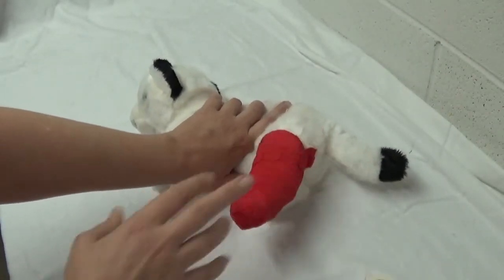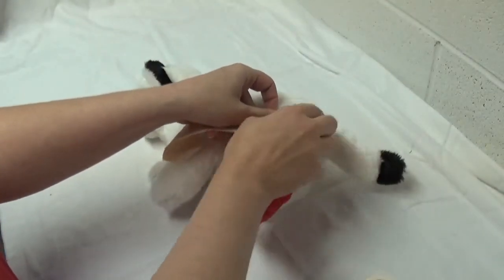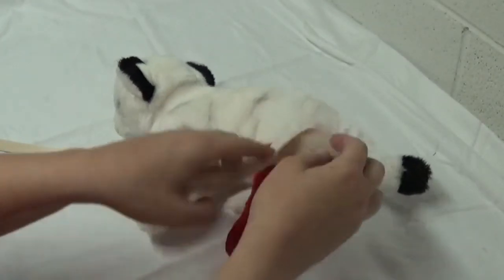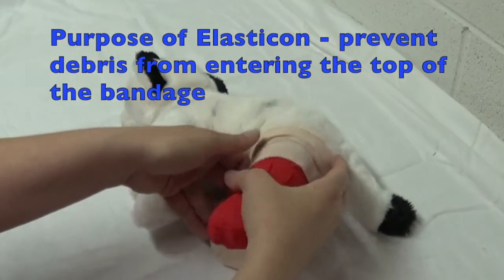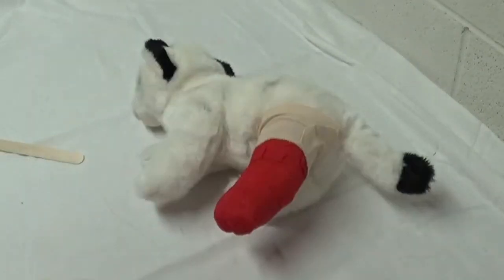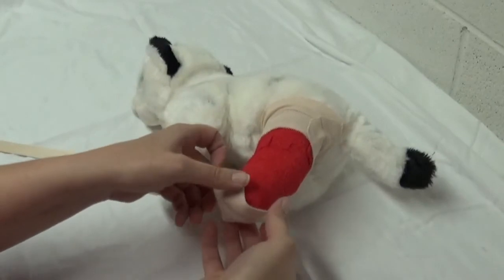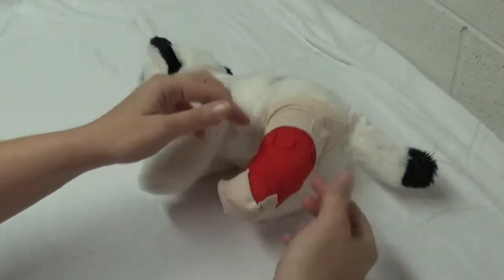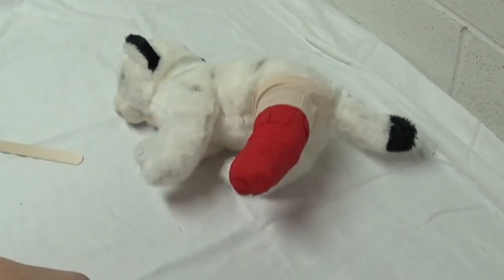You shouldn't be able to pull the bandage off at this point. Take a little bit of Elasticon and go around the top of the bandage, making sure you grab 50% of the bandage and 50% of skin — hopefully not hair, as it's going to be painful coming off. The purpose of this is to prevent anything from getting down into the bandage. Some people also like to put a little Elasticon around the toes to extend the durability of the bandage. There is an art to bandaging and making it look good.